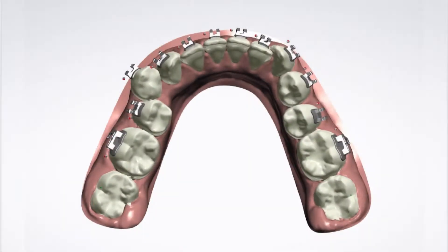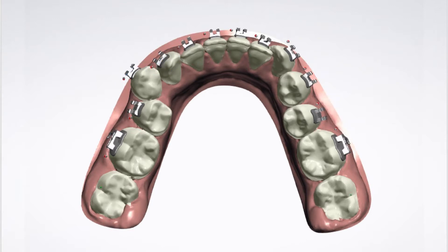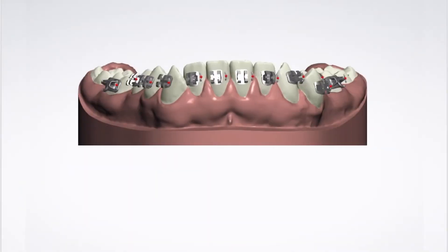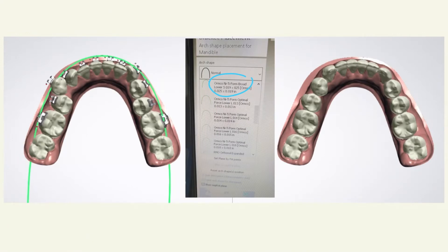The software used here was OrthoAnalyzer from 3Shape. When I connected remotely with the technician, we reviewed a couple of brackets — for example, one appeared a bit too distal on one tooth, and the canine was also placed more distal. I asked him to move it more mesial since it was too close and would not help with wire engagement. We confirmed the heights, mesiodistal positions, and long axis from different views, and made a couple of changes.